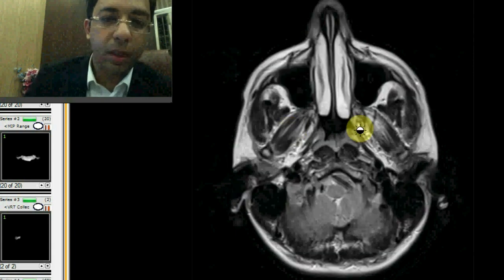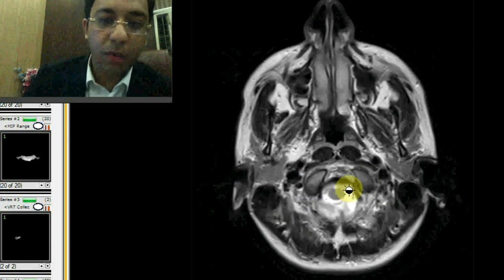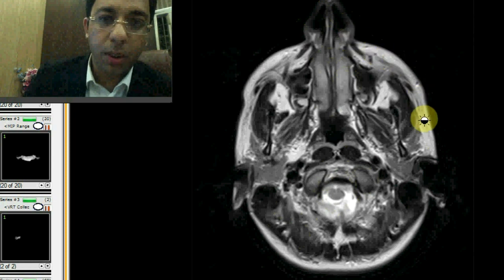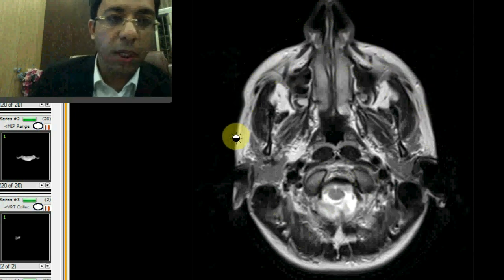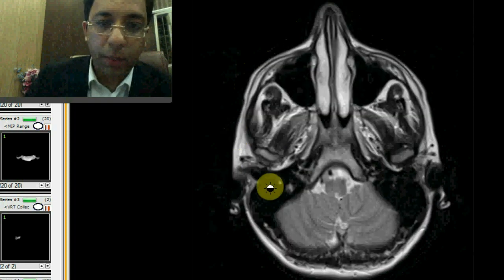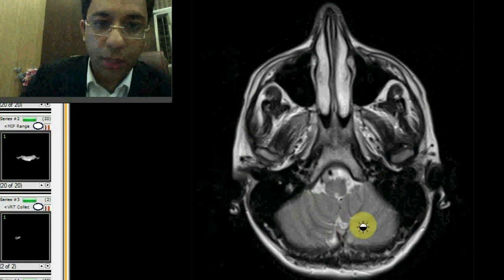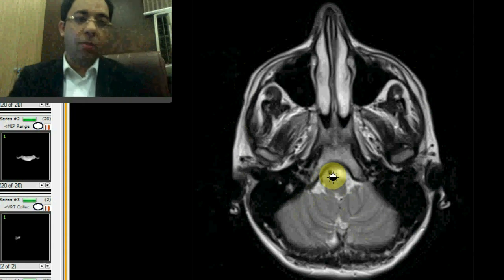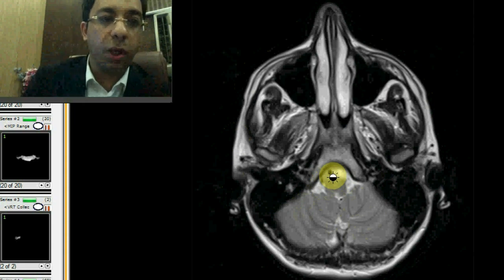At the bottom level we are able to see the spinal cord, nasal turbinates, nasal septum, and nasal openings. Subcutaneous fat appears as a bright signal — fat appears bright on both T1 and T2 weighted images. As I go up, you can see the cerebellum and medulla. Can you see two black dots? These are flow voids — flowing blood appears as a flow void on an MRI image.